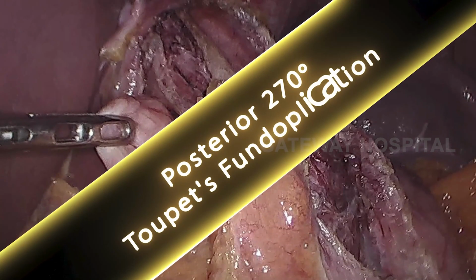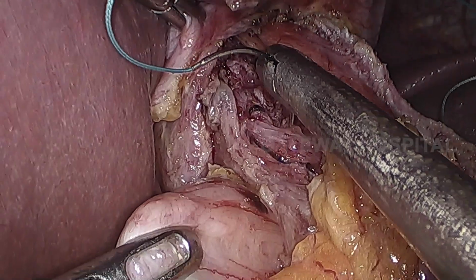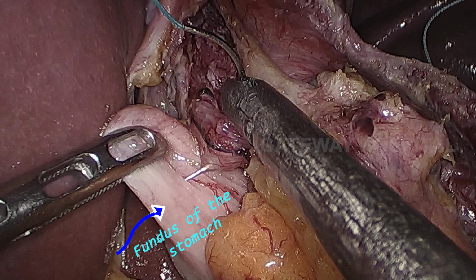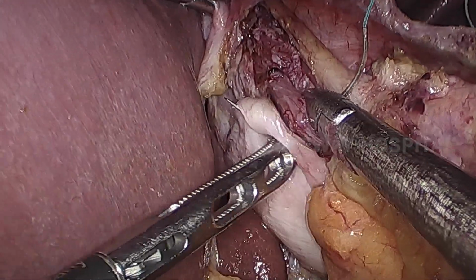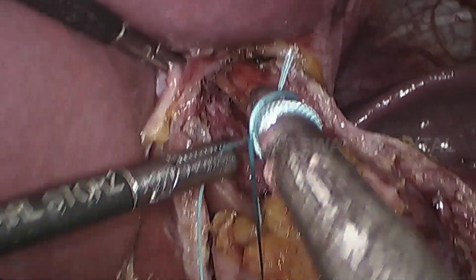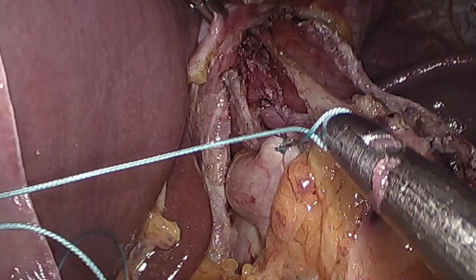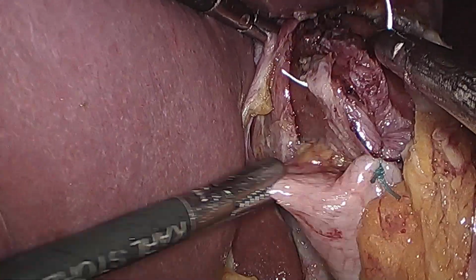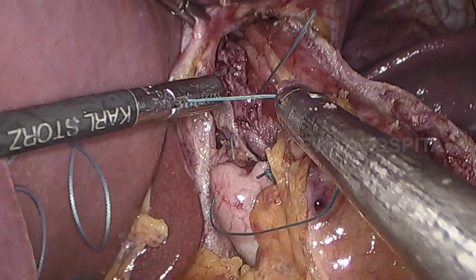Once the myotomy is completed, we do an anti-reflux procedure, that is posterior 270-degree Toupet fundoplication. We use non-absorbable suture. We take a bite between the right side cut end of the muscle fiber and the fundus of the stomach. The fundus of the stomach has come from the left side to the right side. Normally we take around 3 sutures on either side.